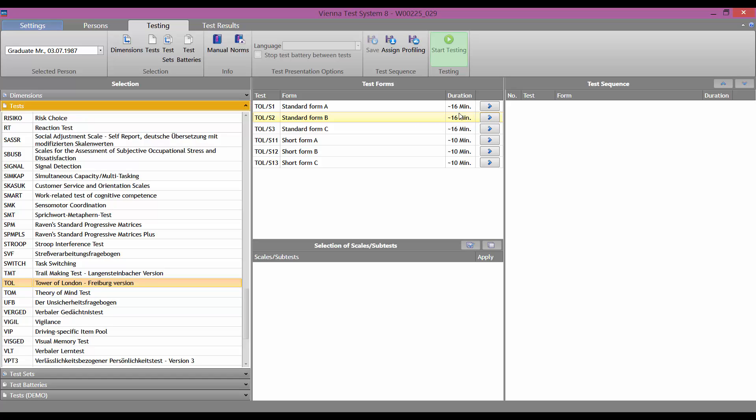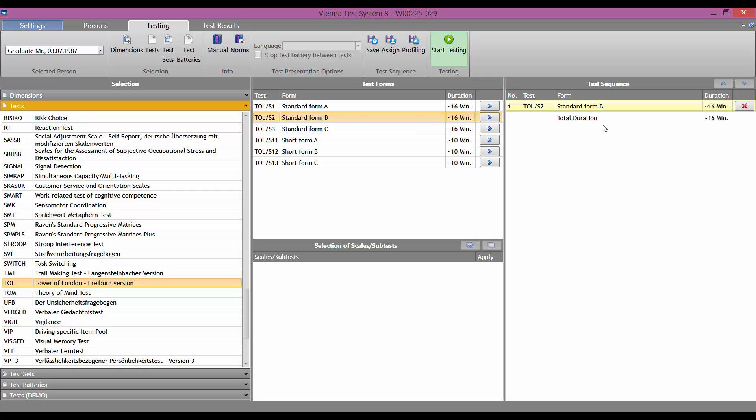Once we have decided on form S2, standard form B, we click on the little blue arrow next to the test form. The test is then moved into the test sequence column, on the right. This also activates the start testing button. We can now start the test session.